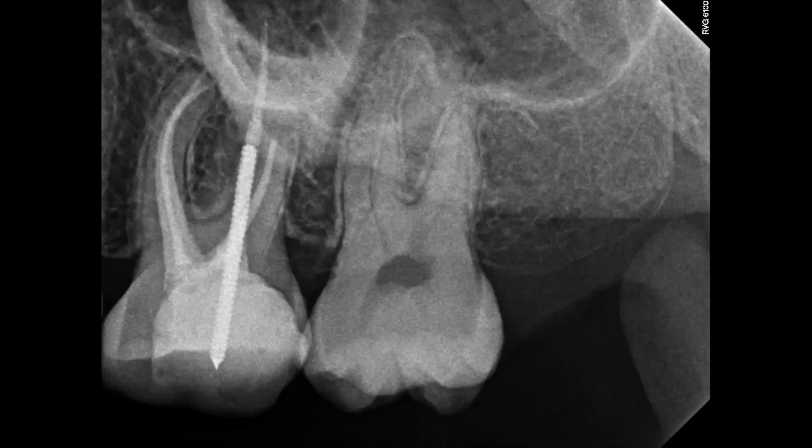As you can see, this is the final x-ray result — a pretty densely packed root canal system with four canals. Post buildup is complete and this patient is now ready for final restoration. I hope you found this video useful, and I hope it's helped to make your practice a little more enjoyable. I hope you continue to watch these videos.